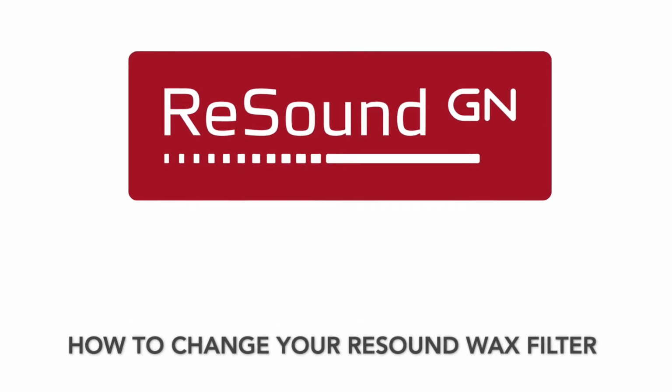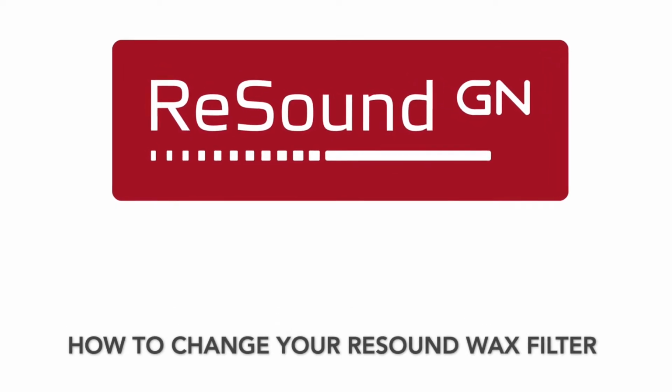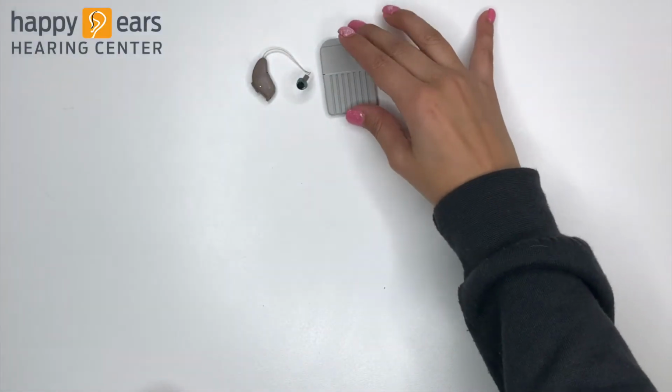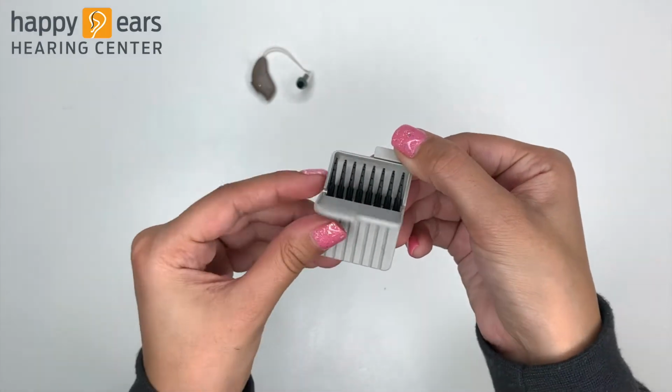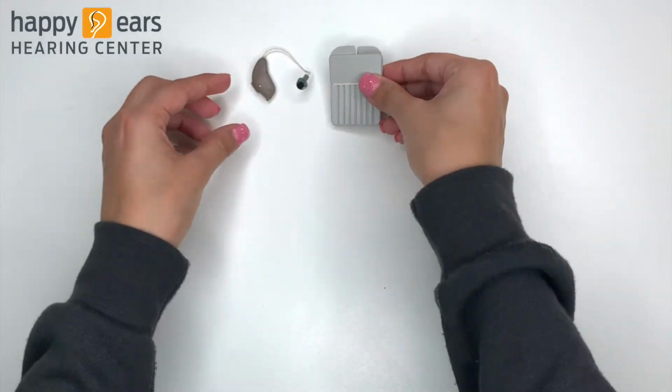In this video, we're going to show you how to change your ReSound wax filter. First, you'll need your pack of ReSound wax filters. Then you will need your ReSound hearing device.